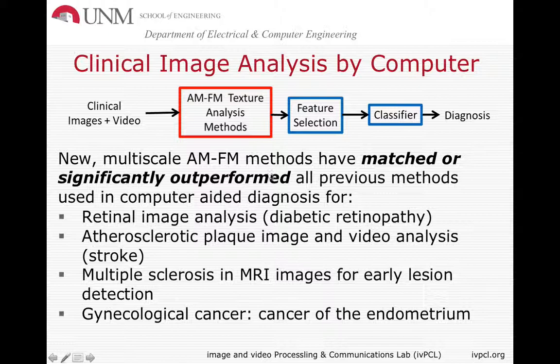We looked at many systems here. The one that we're going to show is the one based on retinal image analysis, where the goal is to screen the entire population beyond a certain age, because we want to avoid people from going blind. So the hope is to screen for diabetic retinopathy. These kinds of technologies are being investigated for plaques.